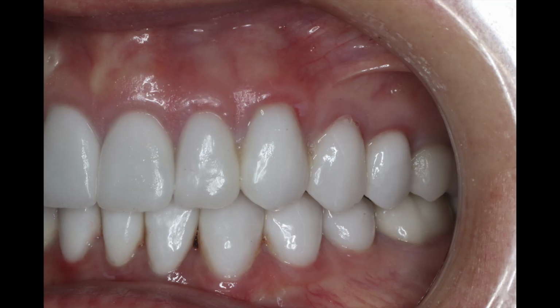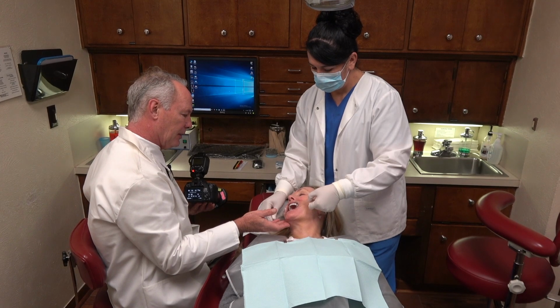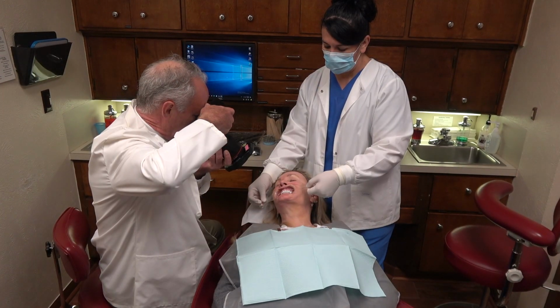and this shows abfraction, exposed crown margins, gum line decay. Now turn that way just a little bit. Bite down all the way. These are two lateral views.